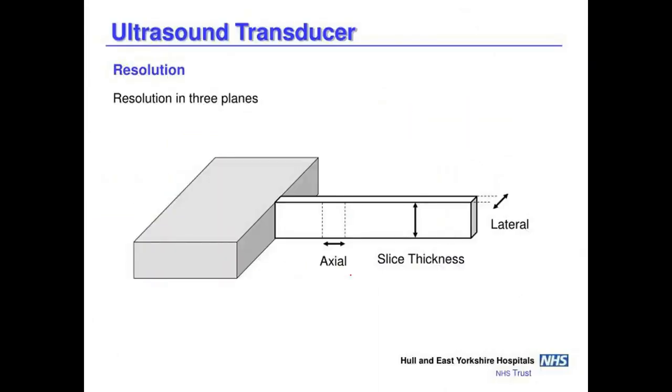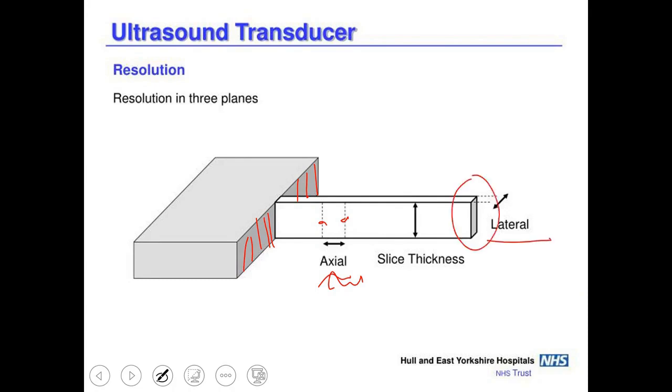I have an ultrasound transducer, as I mentioned, which is arranged in this way. There is elevation here, or height. This height represents the elevation plane, which is the thickness of your slice, the thickness you are taking. There is also axial resolution, which is how you separate two objects if you want to distinguish between them. Axial resolution depends on frequency and pulse length. As for lateral resolution, it depends on line density, how many lines are present, and the width of the beam.